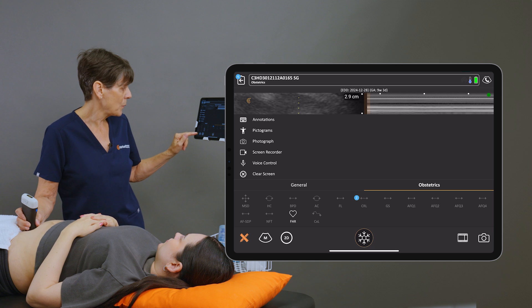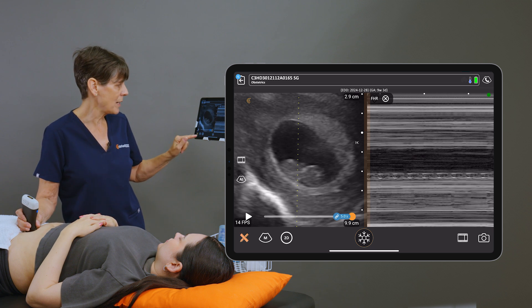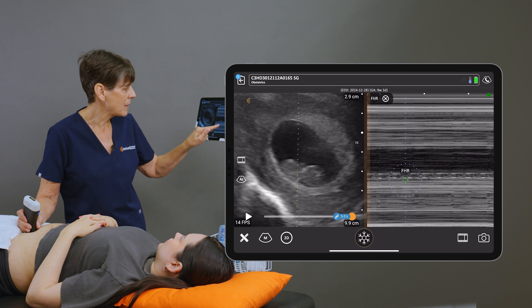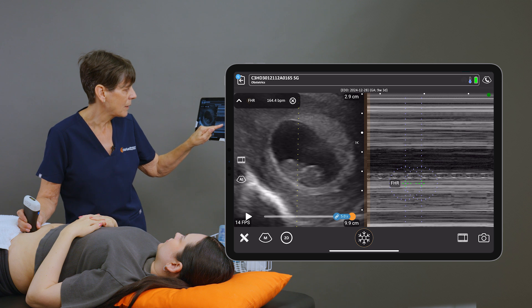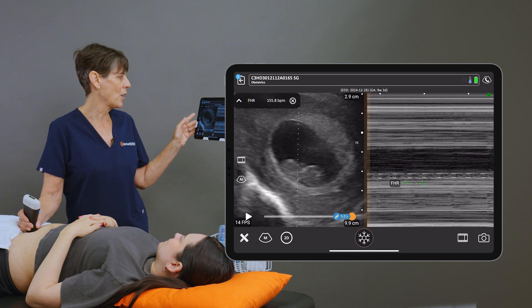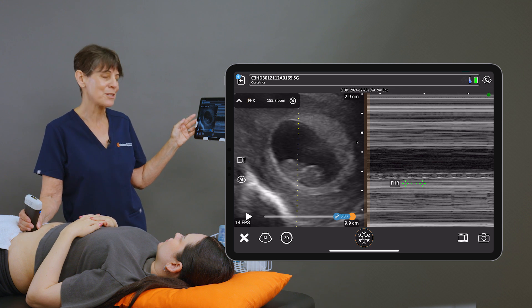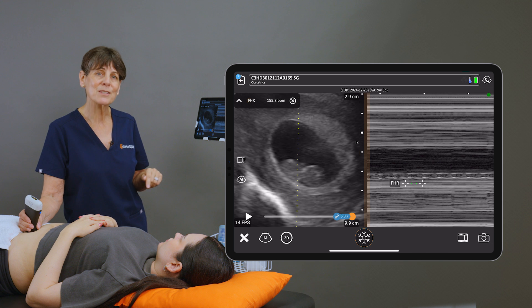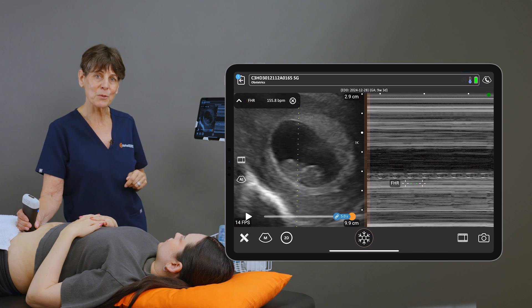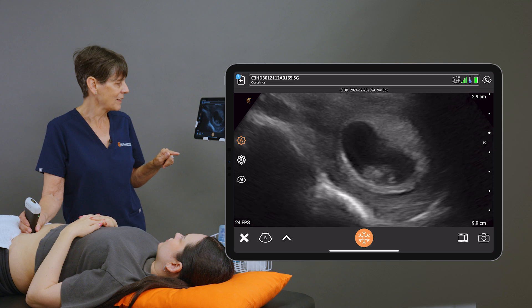From here we can go in and select the fetal heart rate icon and place our caliper at one cycle. I'm getting a heart rate of 156 beats per minute, which is normal for this time. We'll take an image of that so that the measurement goes into the report, and then we can go back to live imaging.